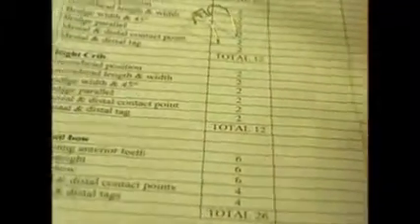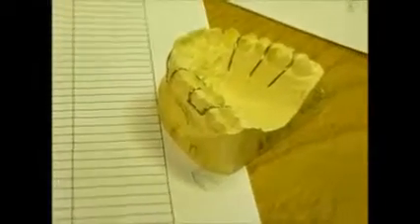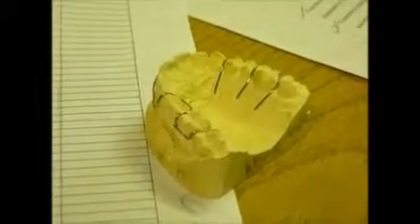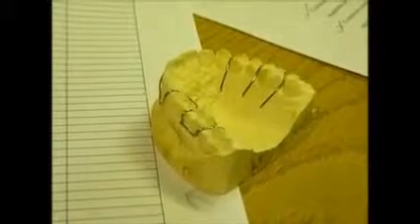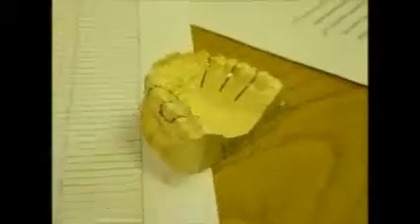So those are all the ways to look at it. It's quite a lot of things. Because I think if you can understand how the marking system works, then it probably helps you to understand how to make an appliance that would work. And so basically you pass if you've got something that would stay in, that would do the job. You do really well if you make it look nice as well at the same time, and you would fail if it's a sort of appliance that couldn't be worn, couldn't be adjusted, and wouldn't do the job.